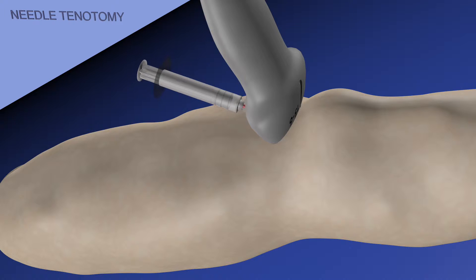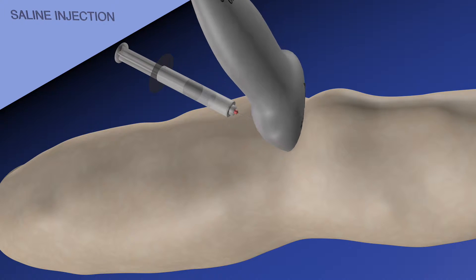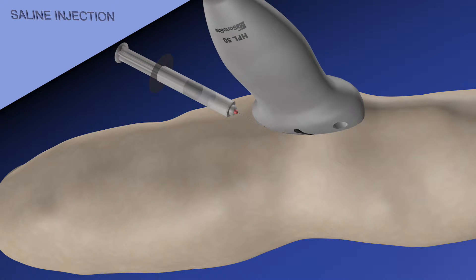It's also good to look at the needle in a short axis plane or axial view to get a better sense of the medial-lateral orientation of the needle. Here we are injecting saline again with the needle in long axis or sagittal view relative to the body. At the very end we're doing a cortisone injection.